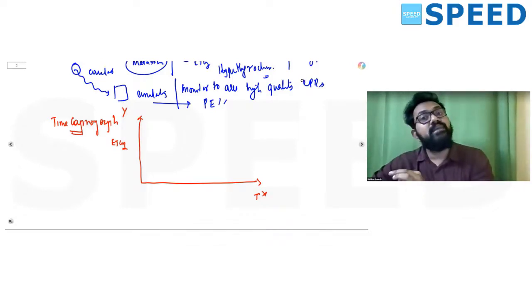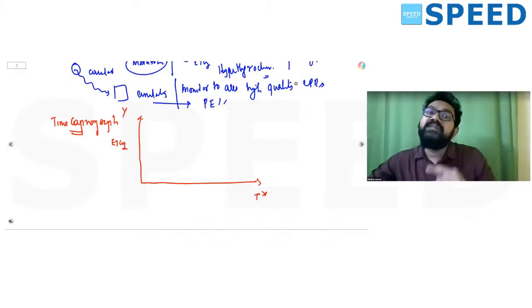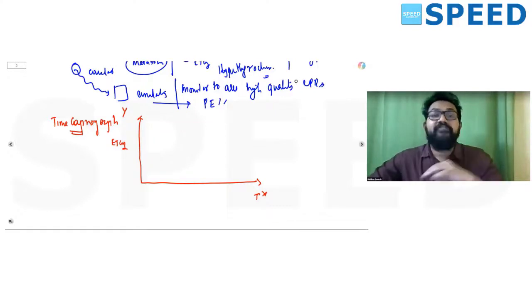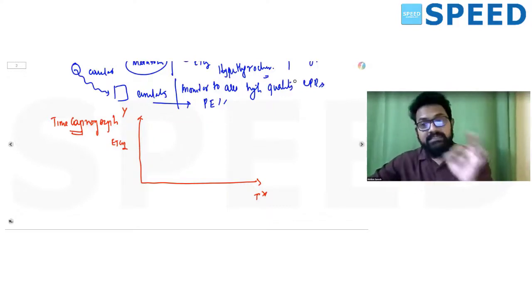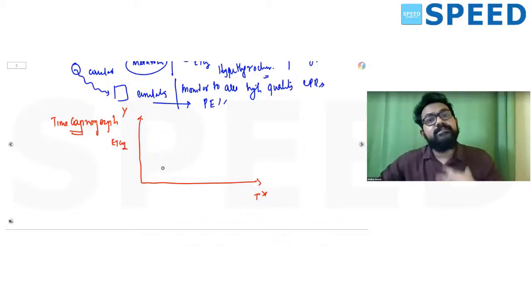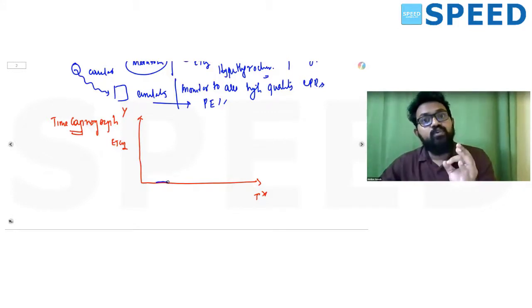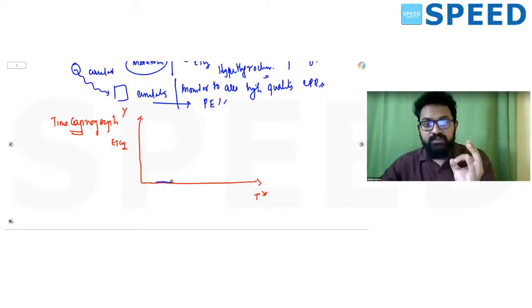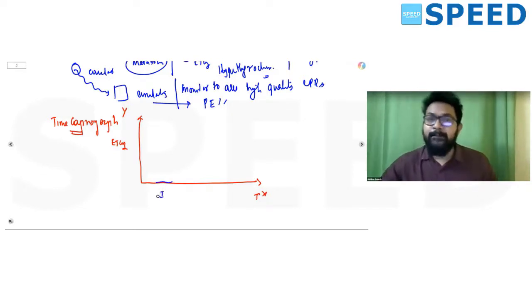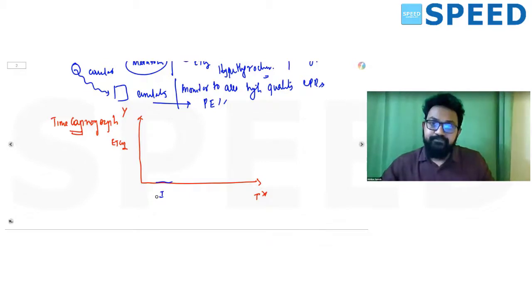Dead space means that it has not taken part in respiratory exchange. Remember, carbon dioxide enters into your air with the help of respiratory exchange. So if respiratory exchange has not taken place, it essentially means that there is going to be no carbon dioxide. So in the first phase of respiration, where there is only elimination of anatomical dead space gas, there is going to be no carbon dioxide. So this is phase 1 of your capnography, where there is absolutely no carbon dioxide.